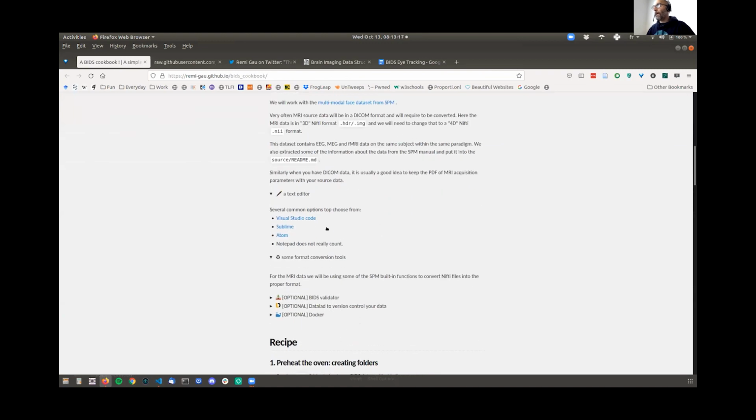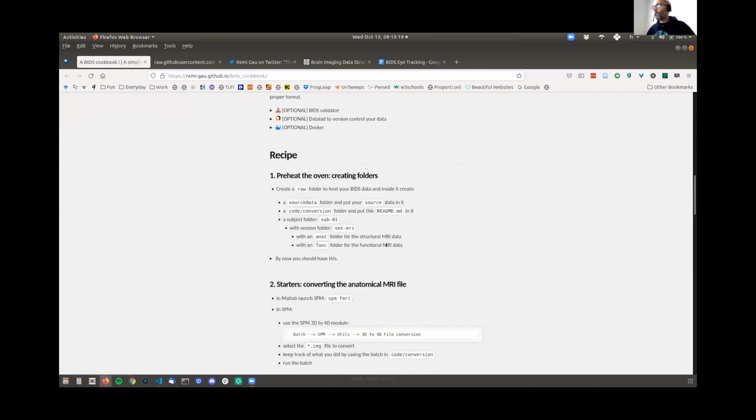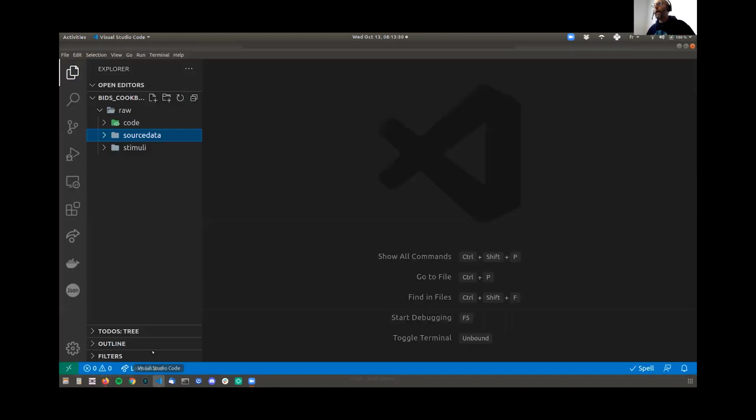So we have our folders. Okay, so we have the data for one participant. So we're going to need to create the folder structure to host the data for that participant. Okay, let's do this. The way you do this in BIDS is anything that's a subject folder has sub as the prefix, and then you have a label for that participant. Labels can be anything with letters and numbers, it's fine, but no special characters in them.